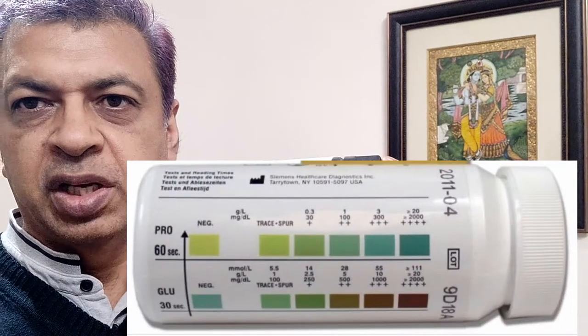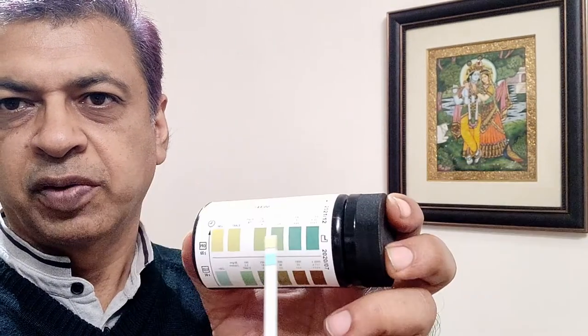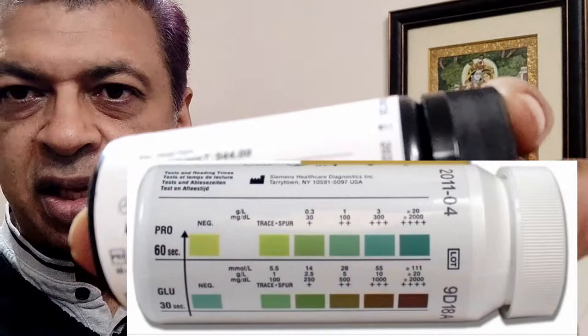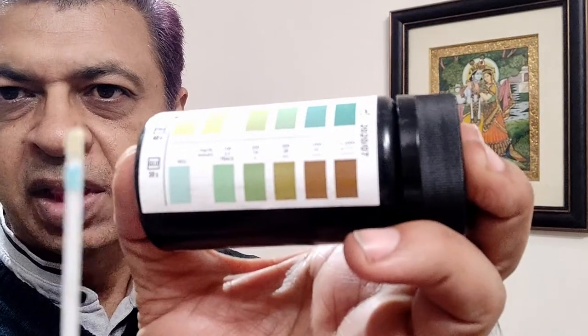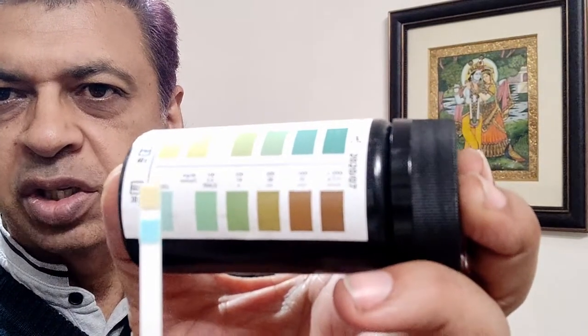Then you match the colors with the colors provided on the bottle. If your protein is kind of high, it will show one of these colors — you match the color and see the reading written on top. For glucose, you look at the one at the bottom and match the color to know how much glucose there is in your urine.